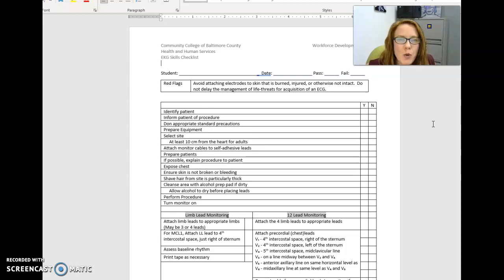So what you do is you walk into the room, identify the patient by asking them their first and last name and their date of birth. You then can pantomime looking at their bracelet. It's their hospital bracelet, which I'm sure everyone has seen one of those before. And then also by looking on your orders, which can either be a sheet of paper or just an imaginary order, because it's really important to identify the patient times three.